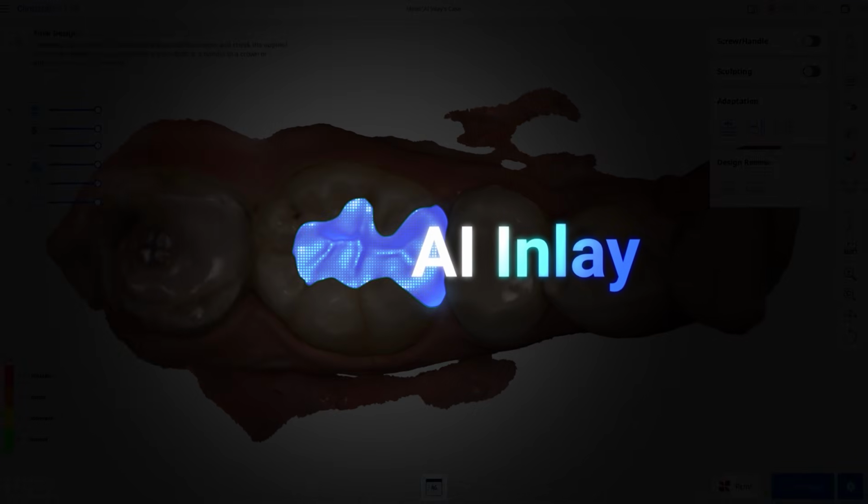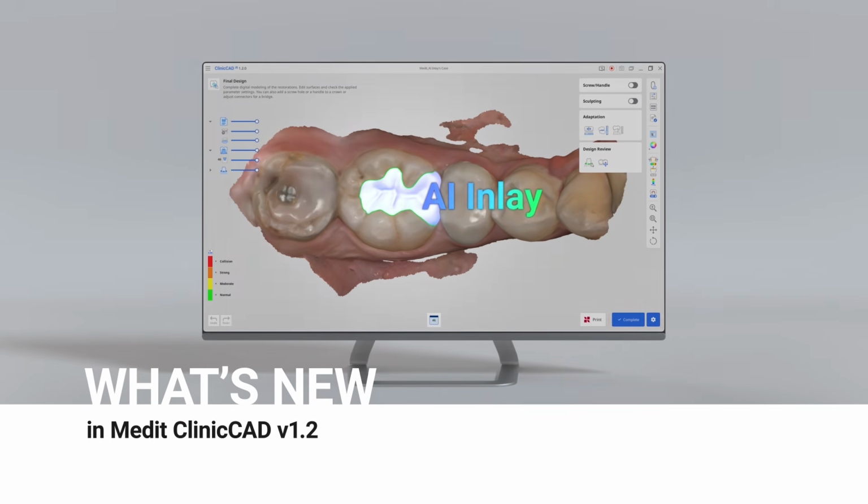That concludes our brief introduction to two new features in Medit ClinicCAD version 1.2. Explore even more advanced digital dentistry features with Medit Academy.